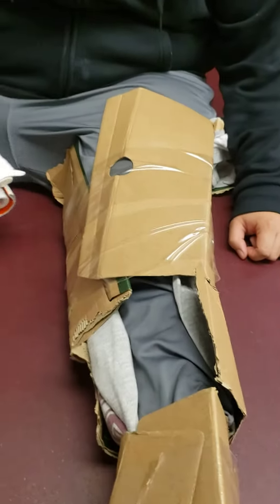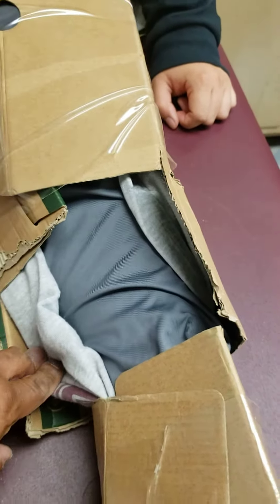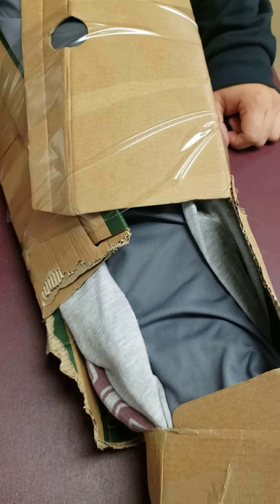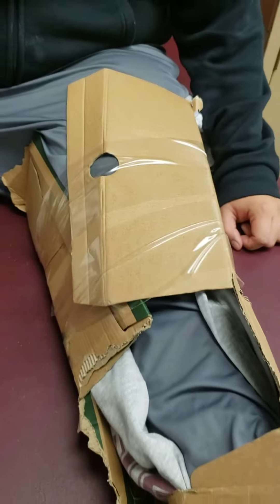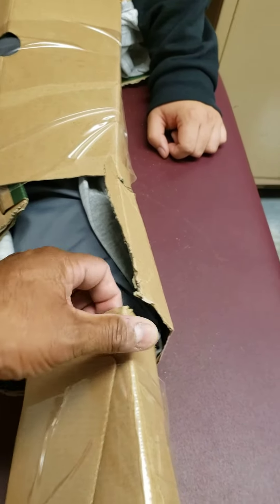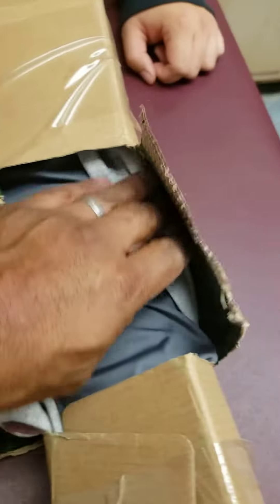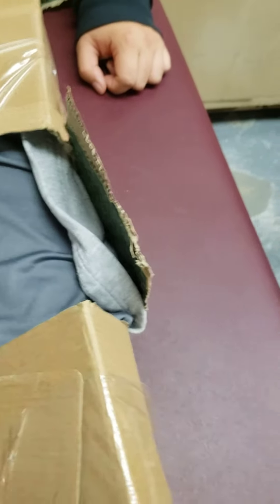The splint you see right here is a big box, and I used a blanket as cushioning between the cardboard and the limb. The padding isn't really used for comfort — it's used to fill any gaps so when you put the box around the limb you don't have any empty space between the cardboard and the limb. It's basically a filler to keep the appendage or the displaced fracture from moving around.